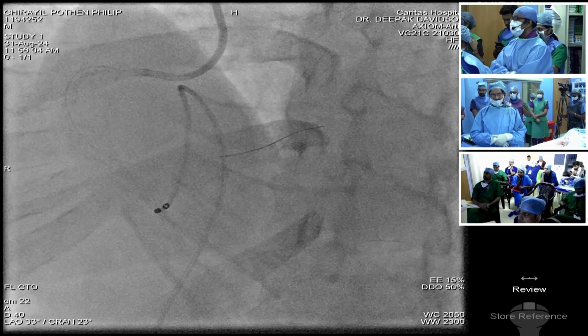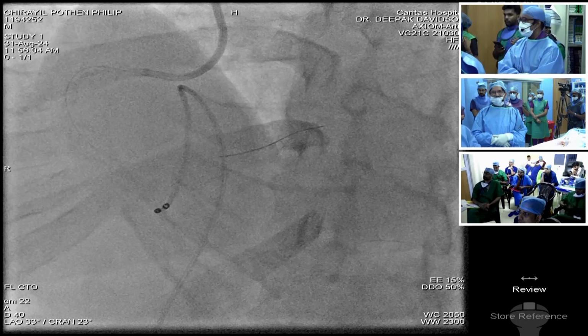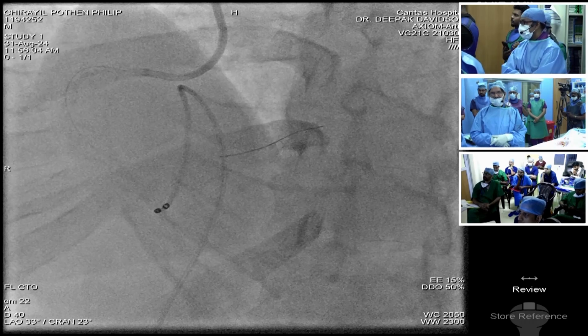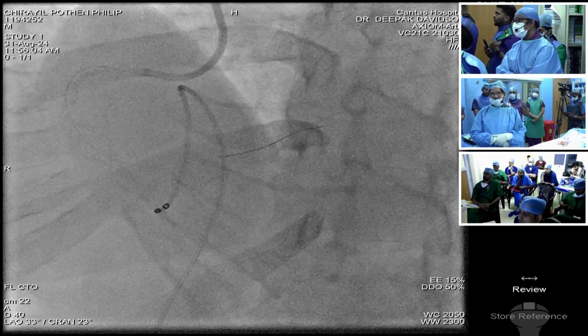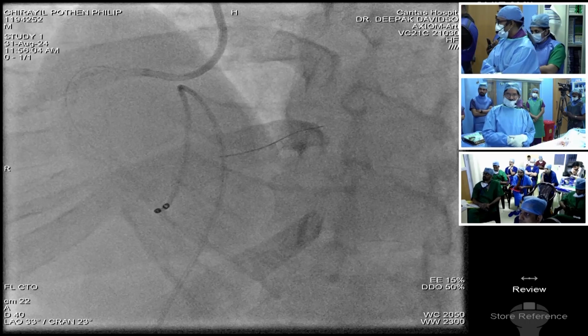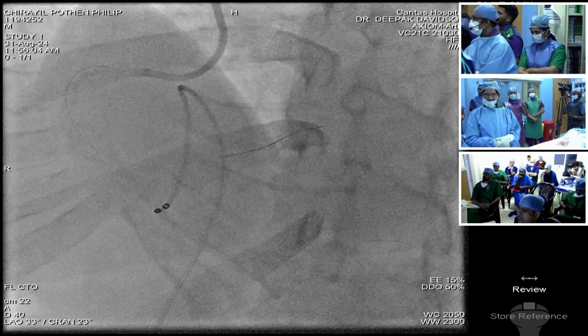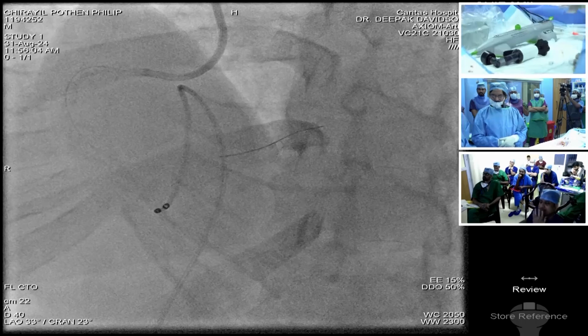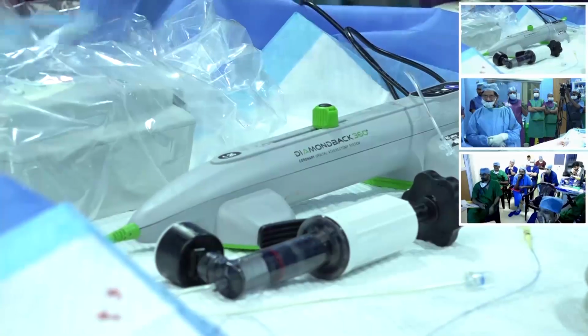The other one was a 2.75, 3-ish vessel. That was the reason why we didn't go at higher RPMs. So here we would start with 80,000 RPM and then go ahead with 120,000 RPM also. Now again, regarding the orbital, can you focus on the table?